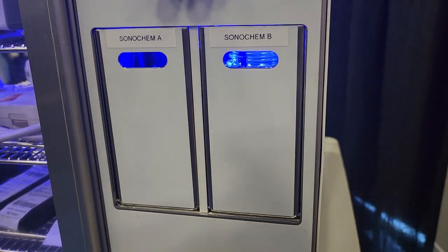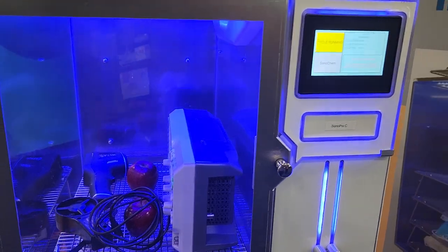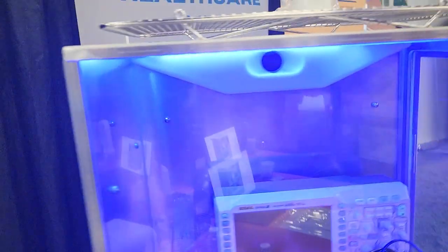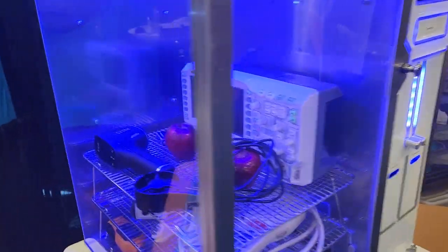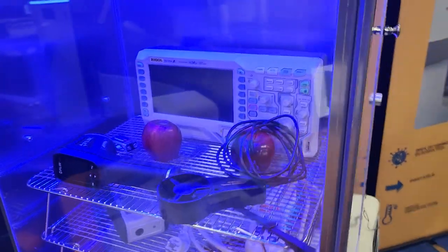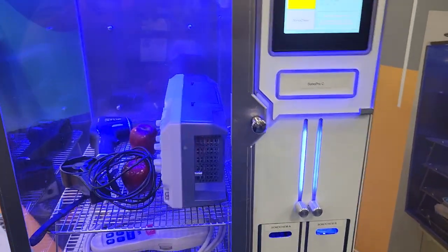Down here is where the chemical is loaded into the device — very cool, very well thought out. You could fit multiple of these cabinets on a shelf and run them. Say you've got a bunch of telemetry transmitters, ECG cables, leads — you could easily disinfect them. Or say you've got a defib that just came back from a code — you could throw the defib in here along with all its cables, sterile cycle it, put it back on the crash cart, and affirm that it's cleaned and ready to go.